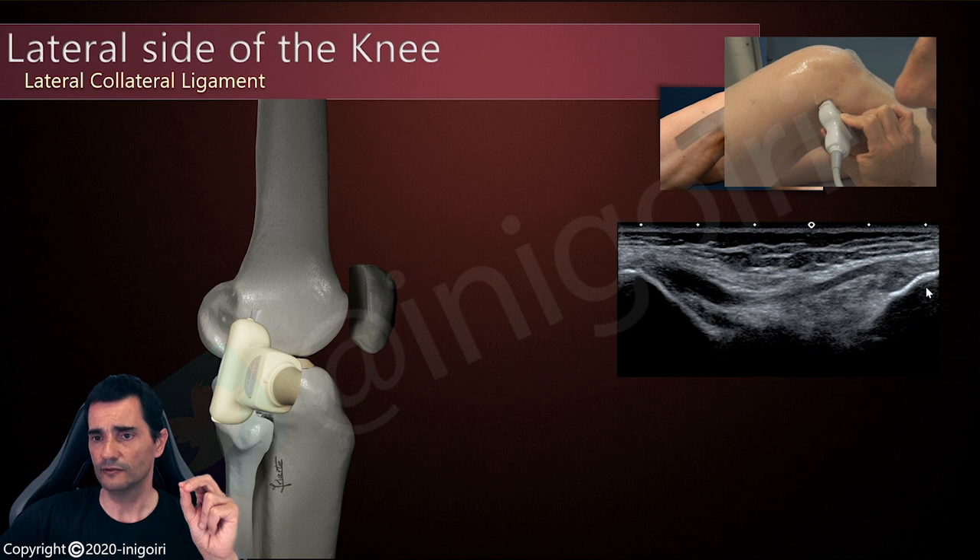Always check the fibula, the cortical of the fibula, and try to find this fibular structure here. In this position, the ligament is relaxed. So it's very difficult to assess mild strains, mild injuries, on the insertion of the ligament at the epicondyle or the fibula.